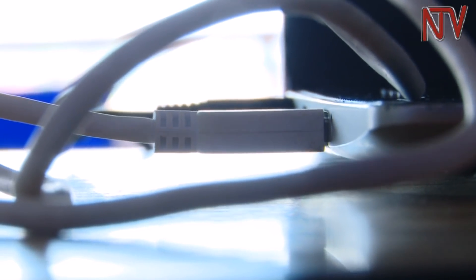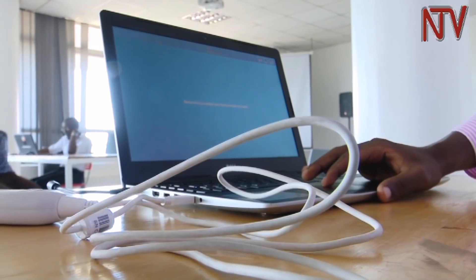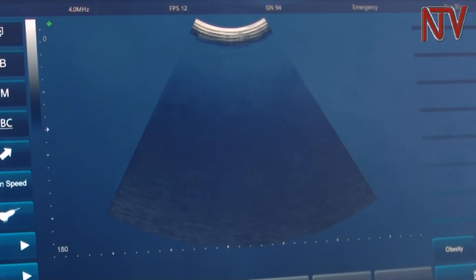The USB cable of the curvilinear scan probe is inserted into the laptop port before opening the interface of the mScan software. The probe will be recognized by the laptop software, which opens an interface of the scan. When you connect the probe, ultrasound starts running on your device.